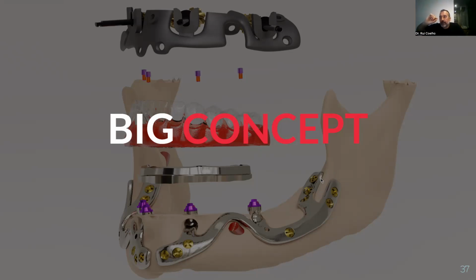The mandible has so little flexion on these points that it's not enough to take the screws out of the plate. When we see those large plates on the border of the mandible, what we find several times is that lots of screws come out of the bone because of this flexion. So the same concept: we use special burrs. There is a special burr for the posterior region. We try to make a chamfer on the external oblique line and on the internal oblique line, and we use muscles to protect our fixation.